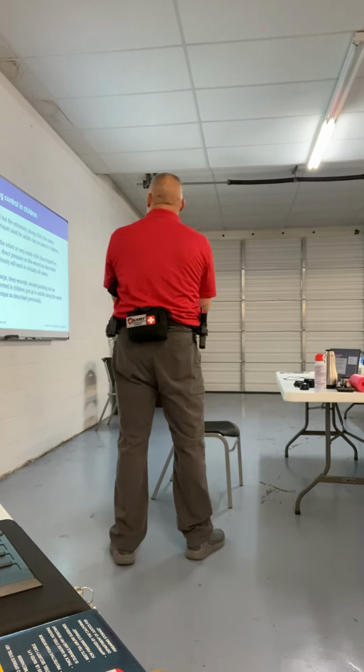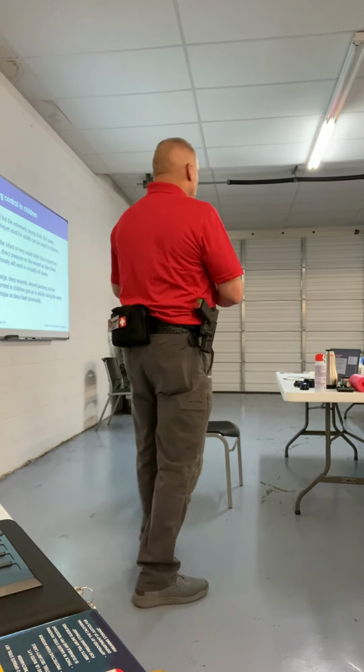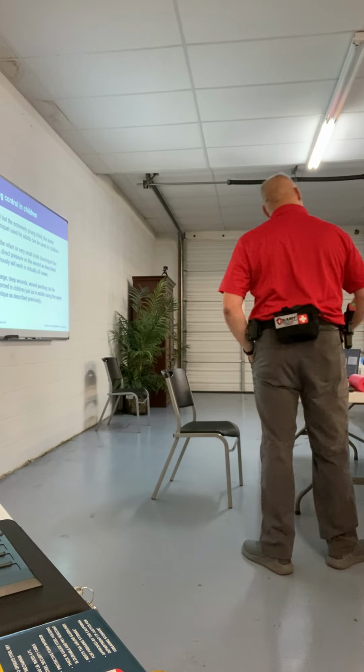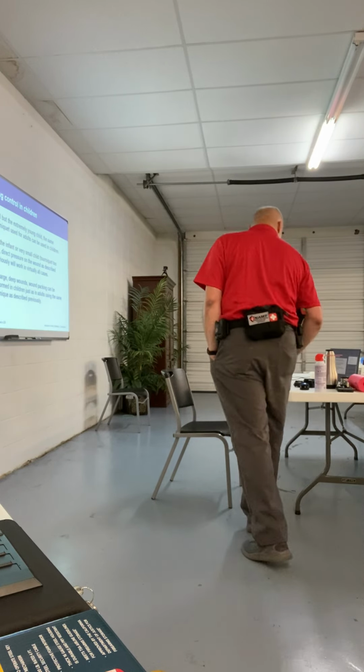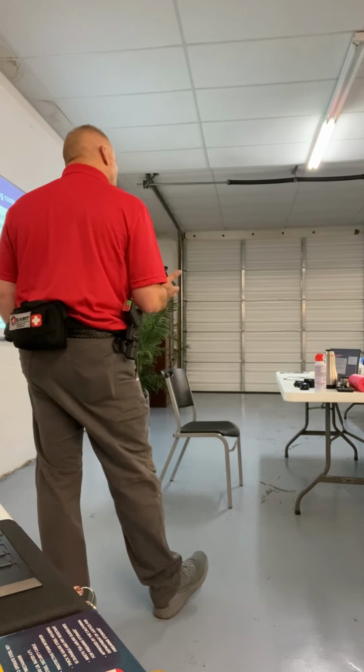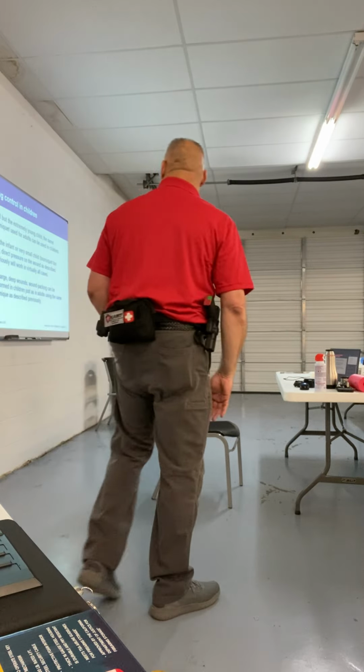That'll stop most bleeds in children. If you have to pack a wound, you can do that. If you feel like they need a tourniquet, put one on. I'd rather the ER doc or the surgeon take it off and say it was overkill than for the kid. With a blood volume of probably 2.5 liters, 3 liters at most when they're little, right?